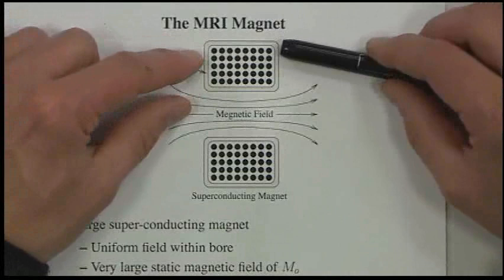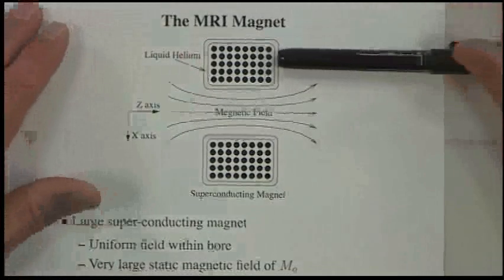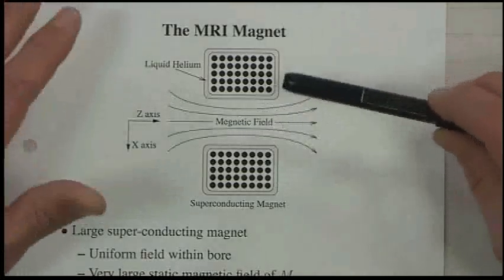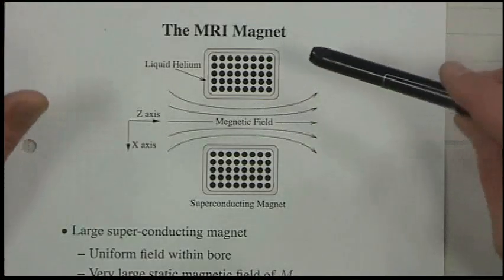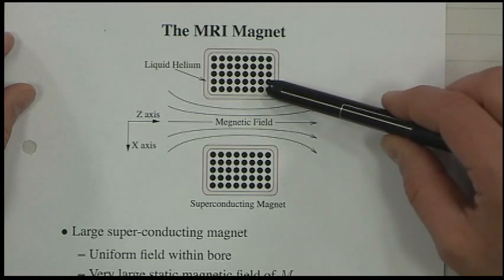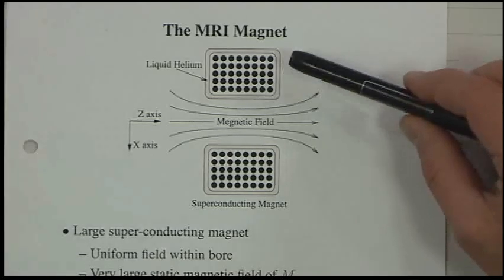And actually, there's a phenomenon, and in all MRIs this doesn't happen too often because the magnets are designed to be pretty robust. But every magnet has to be designed to handle the event of what's called quenching, which is that if enough of the helium boils off, some of the magnet becomes exposed. Like, for instance, if there was a power failure for a long time, right?